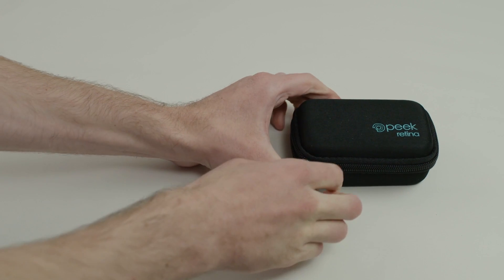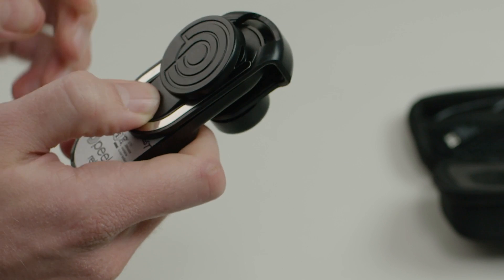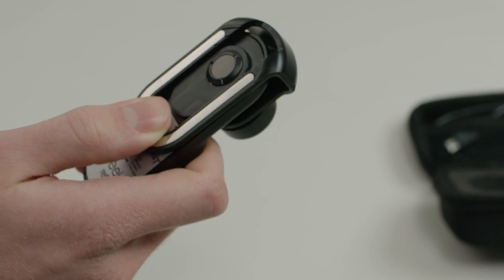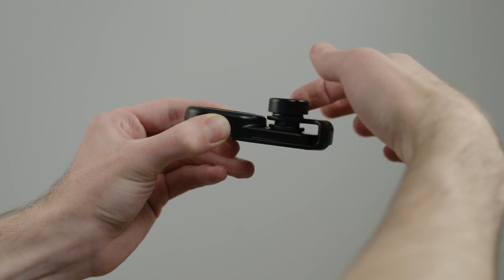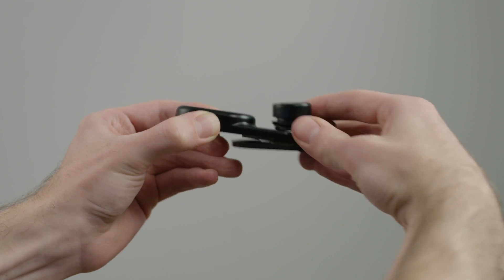Congratulations on being the proud owner of a Peek Retina. Now let's get started. Press to release the lens cap and remove. Rotate the clip dial anti-clockwise to release the clamp and slide Peek Retina from the clip.